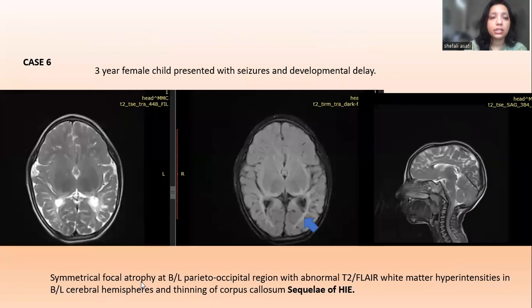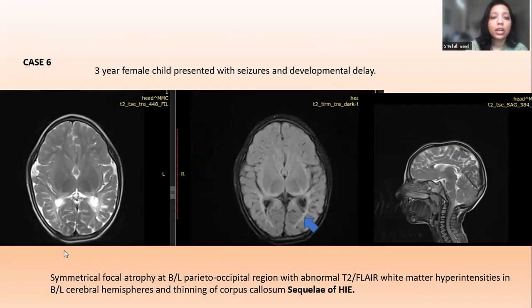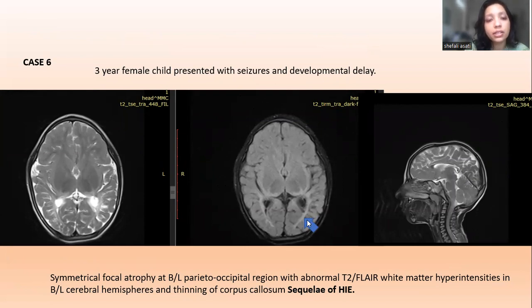Case 6: A three-year-old female child presented with global developmental delay. On T2-weighted FLAIR and T2 sagittal sections, there is symmetrical focal atrophy of the bilateral parietal and occipital regions, abnormal T2-FLAIR hyperintensities in the bilateral cerebral hemispheres, and thinning of the corpus callosum — sequelae of hypoxic-ischemic encephalopathy (HIE).